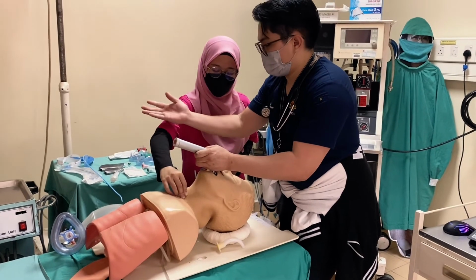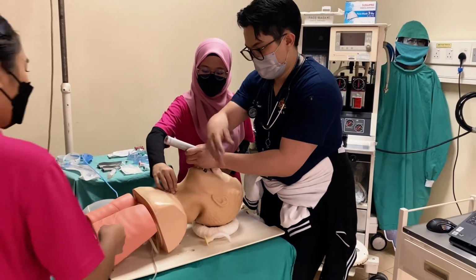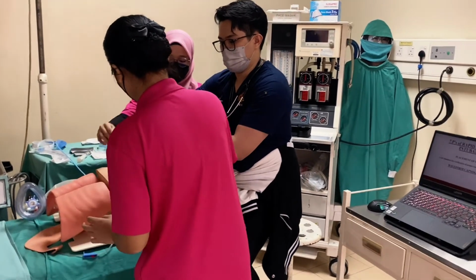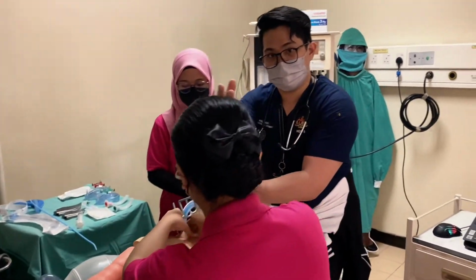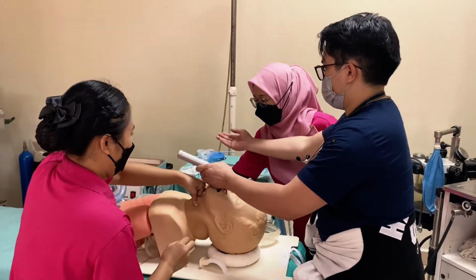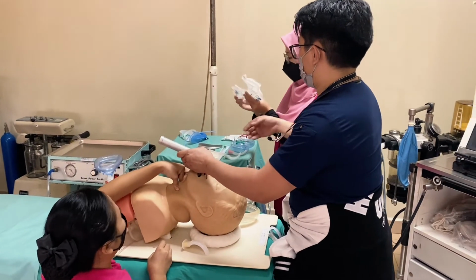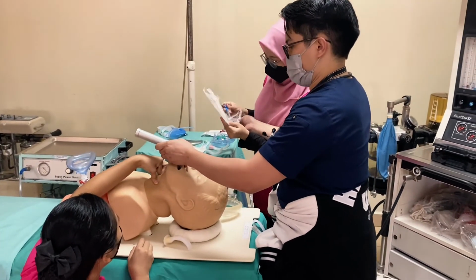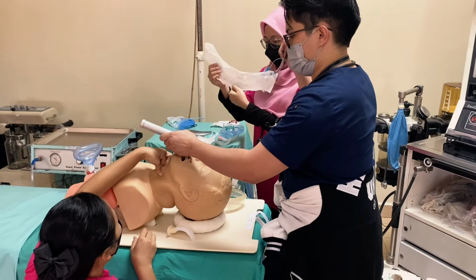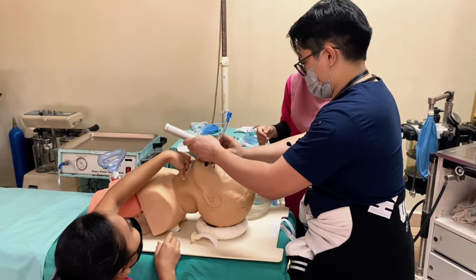Maybe his side might be difficult. We can ask for another assistant. Come, we can provide this. It's okay. Okay, good. And one of our assistants will give us the stylet. Come, give me the stylet. Okay. For example, this is one example of how we'll be doing the placement of it.